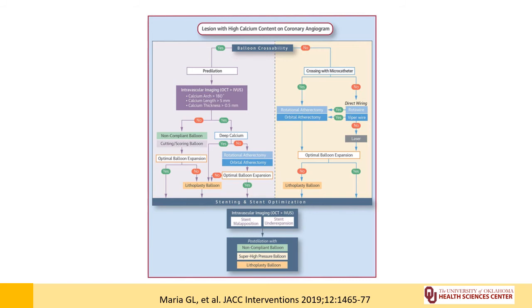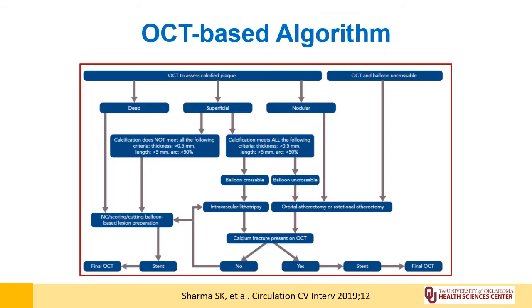Here is another OCT-based algorithm, which is quite similar to the previous algorithm. However, it adds that if there is nodular calcium, then you are better off using atherectomy because that nodule is not going to break without use of atherectomy.